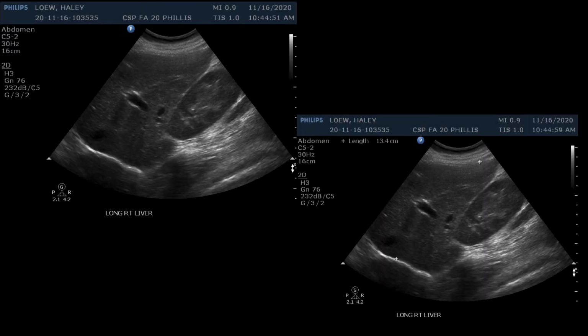The kidney interface image should show just that: the interface between the kidney and the right lobe of the liver. We also measure the liver in this image. Normal measurement should be 13 to 17.5 centimeters. I think my top caliper could have been moved over a bit to give a better measurement of the liver. I also could use TGC to brighten up the far field.